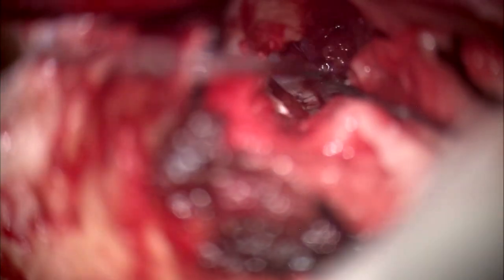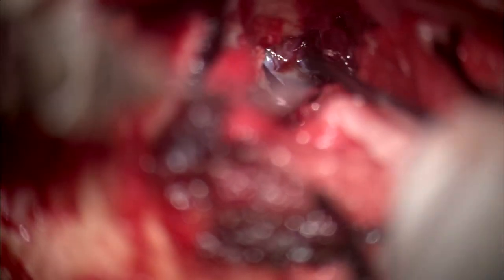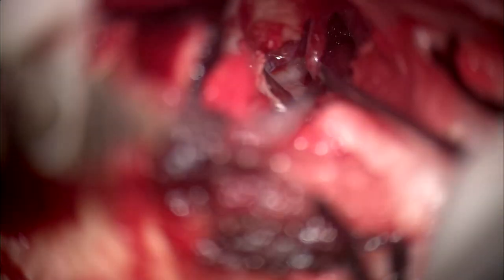See the nerve behind. See the facial nerve behind. That's the facial nerve I have separated from. See this? Yes, sir. Yes. That is still the tumor. That white thing is tumor. Yes. That's the facial nerve. Yes. The whole course of the facial nerve you can see. This is facial nerve there, all the way. Okay. Kusa. We'll show you. See, the whole course of the facial nerve I can see.